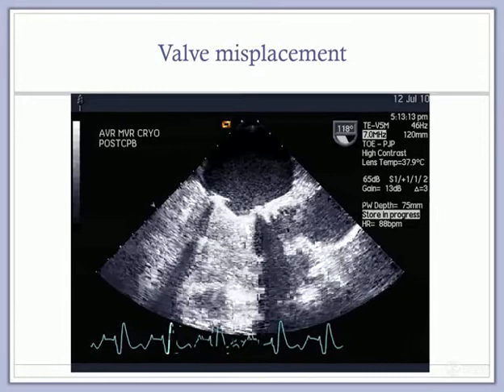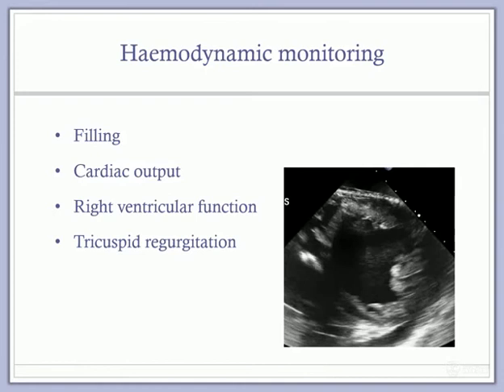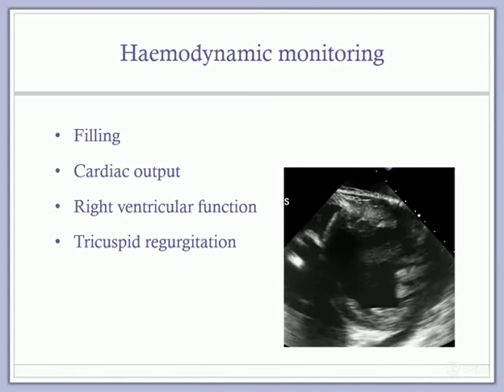Intraoperative echo is used extensively to guide hemodynamic management of the cardiac patient. Size of the LV cavity, contractility and mitral and tricuspid regurgitation guide fluid administration and inotrope usage. This ventricle either needs more time or inotropes, but not more fluids.